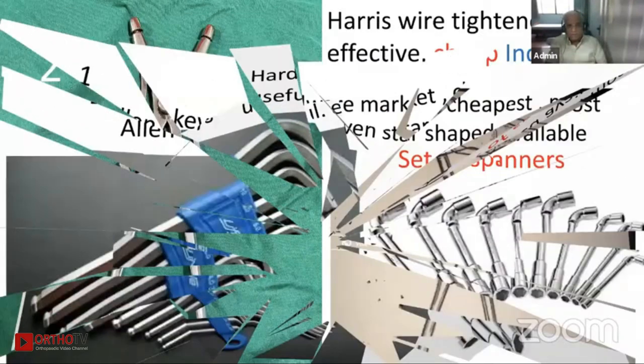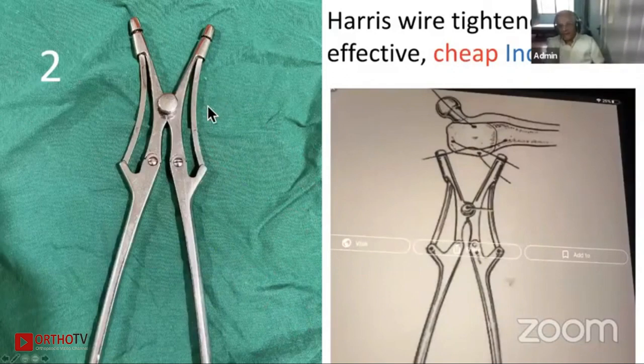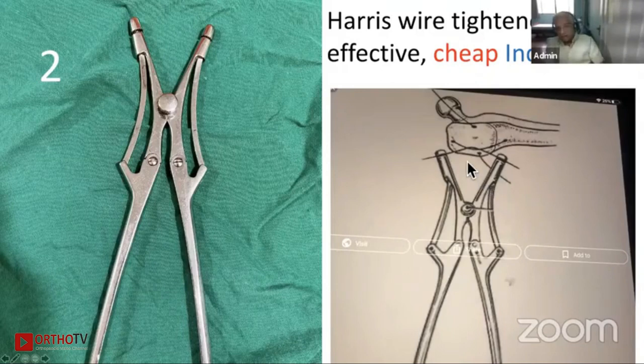This is the second one I use. This is a Harris wire tightener. All the wire tighteners, AO and other things which you have, this is the simplest one which I have used. This is the copy of an imported one. First, we bought it in one of the hospitals, which was an imported one. And then it has been copied, and the copy of the copy, and it has been used everywhere. And this is the one which is easier.